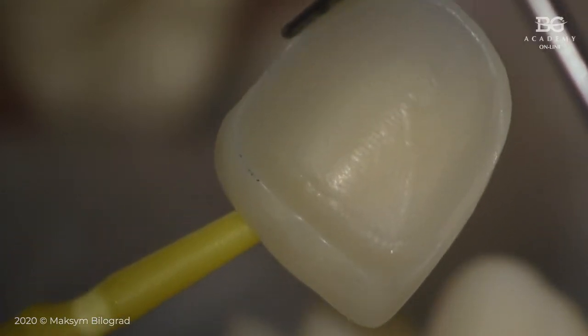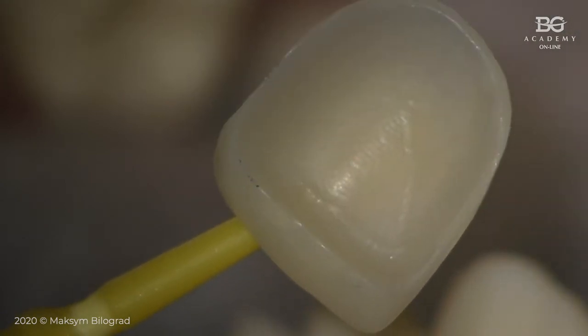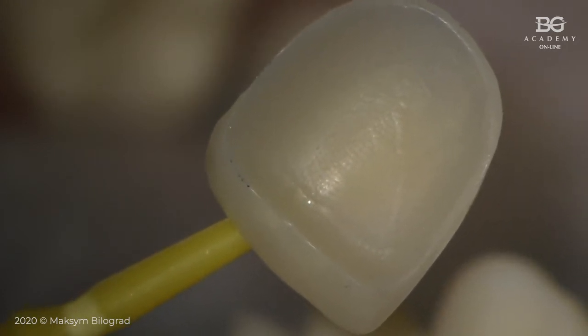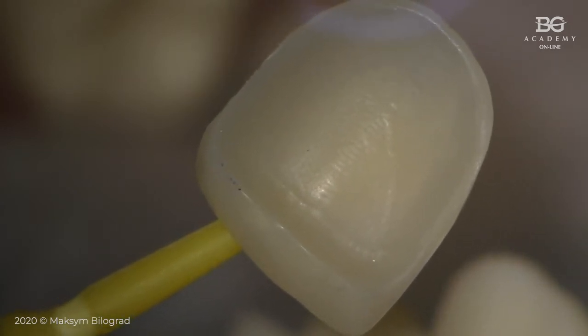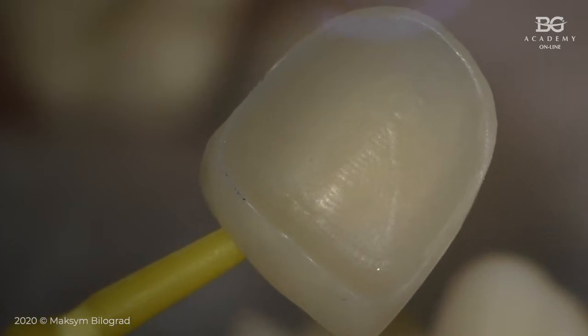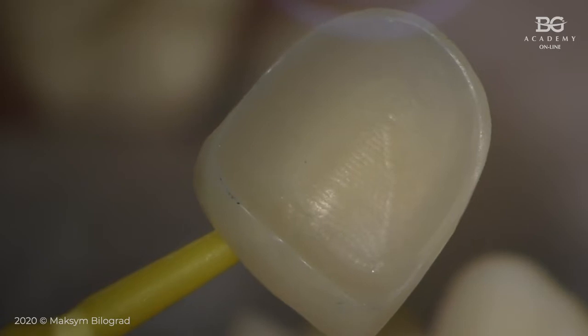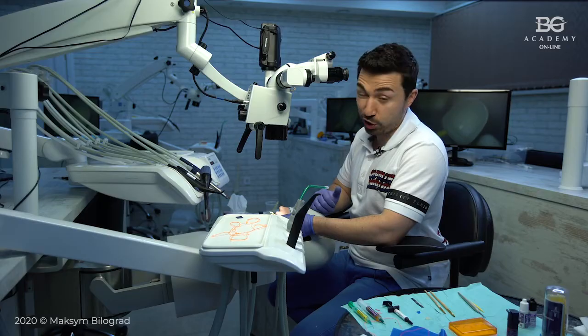If there is any glaze in that area that I'm showing you, you cannot etch it. Actually, you will etch, but the etching will not be efficient in this area, and as you may understand, there will be no proper bonding there. What you may get is a discoloration, a black or brown line between veneer and tooth at the interface, which is not good.